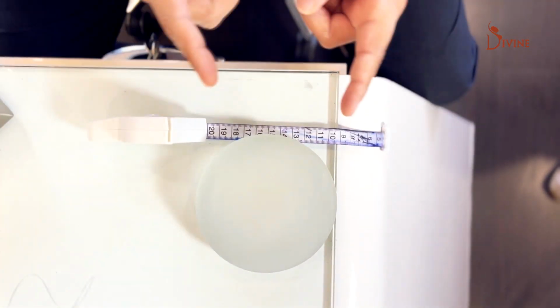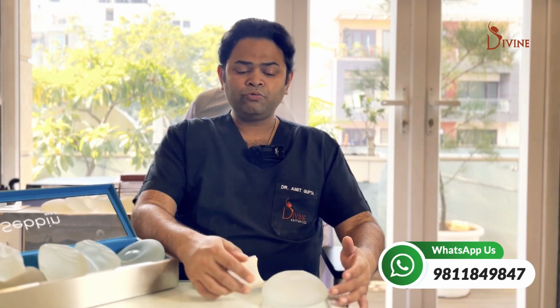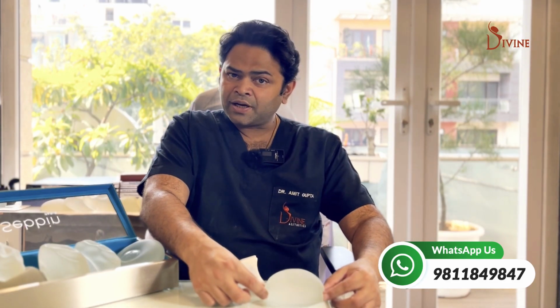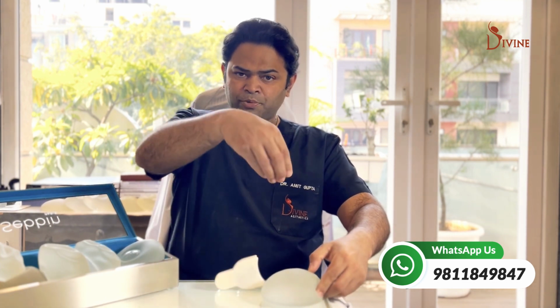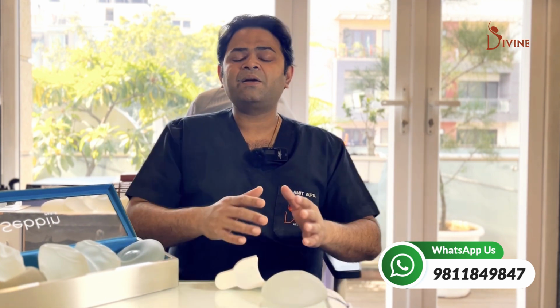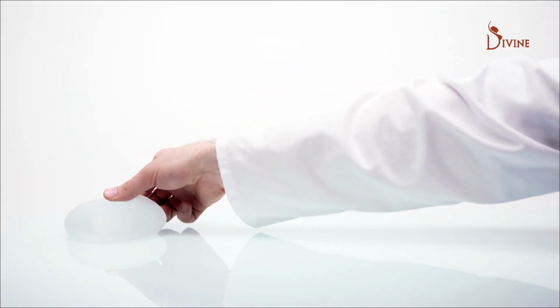Now, suppose the base diameter is 10, but the patient wants a big breast. What do we do? We find an implant which has a higher projection at the same base diameter. That means an ultra high profile. Different companies have different profiles, so it is the choice of the doctor to choose the profile that is best for you.